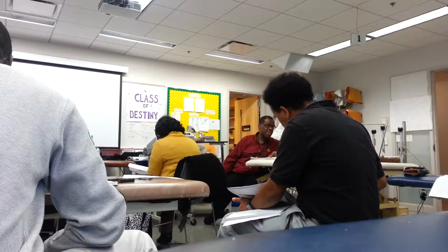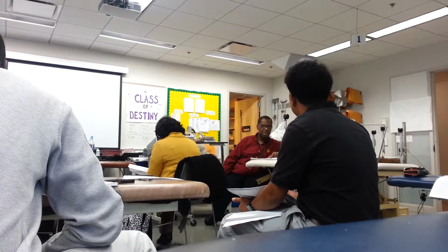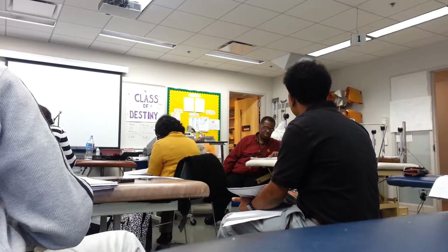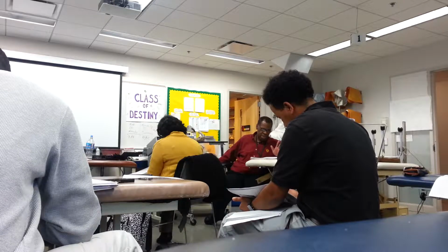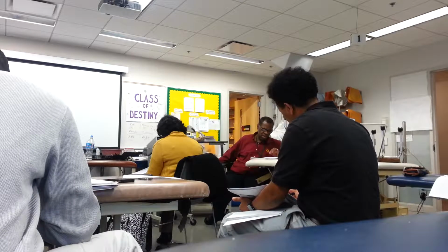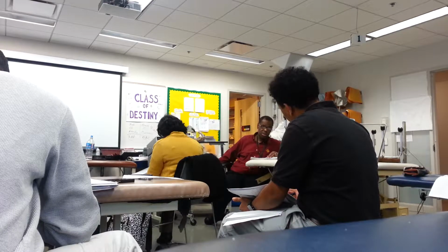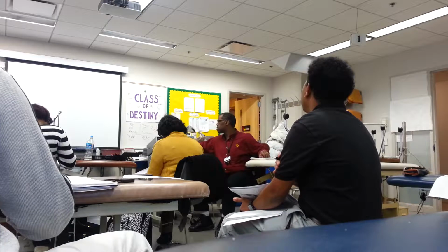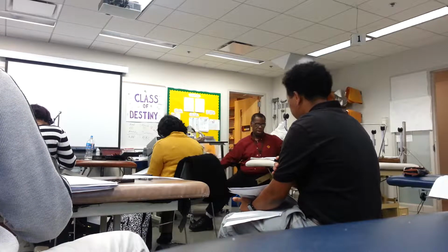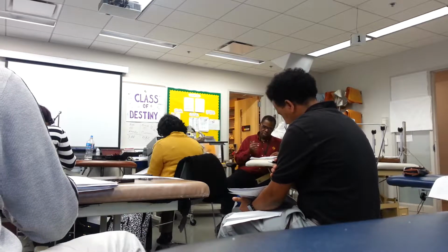Now, why do I want negative polarity? Kill the bacteria. Then I'll turn it up to the tolerance it said to turn it up to. After, or somewhere around the 8th day, when we get granulation, why do I have it on positive polarity? We want some healing to take place. So I'll take it from the negative to the positive. All right, monophasic machine. So you start out negative.